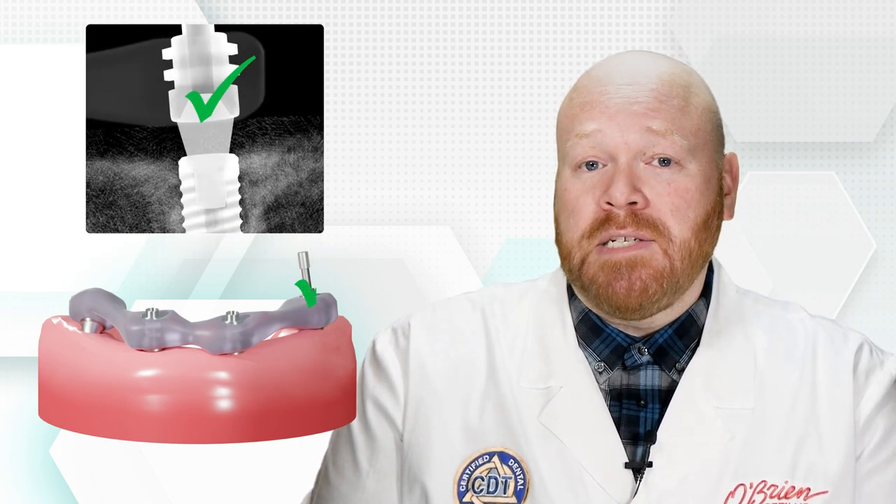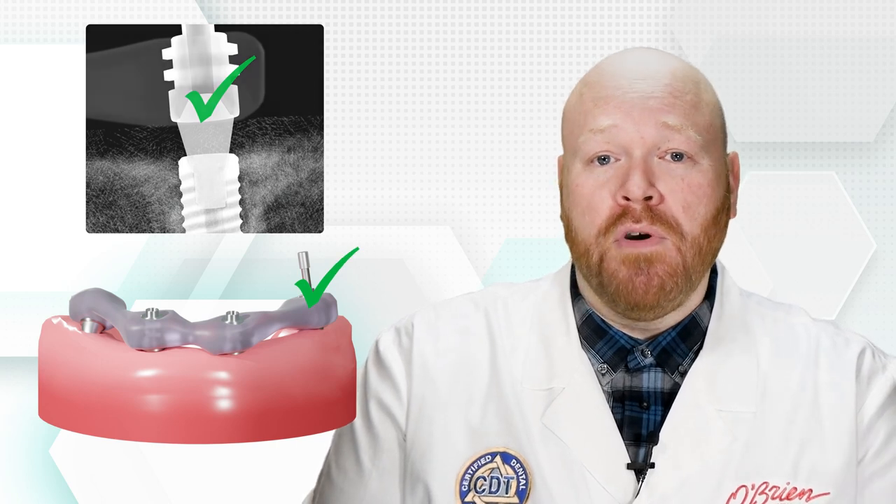If the jig passes verification, you would then remove the screw and repeat the process with the next implant. You'll continue to do this until it's been repeated on every implant.